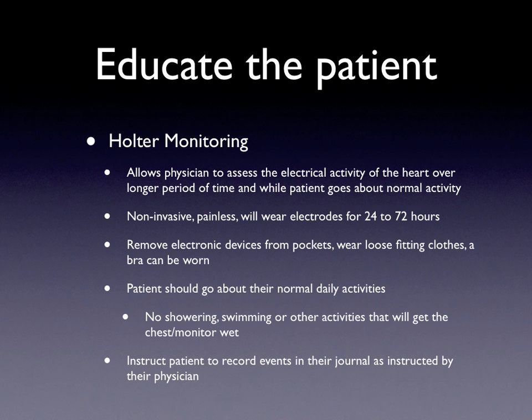Patients, again, should remove electronic devices from their pockets and wear loose-fitting clothes. Women may wear a bra. The patient should go about their normal daily activities, except they cannot shower, swim, or do any other activity where the chest monitor might get wet. So your patient will look right at you, I'll guarantee you, and say, well, what if it's pouring down rain? Well, try to keep it from getting wet.